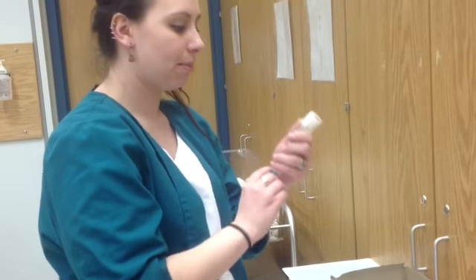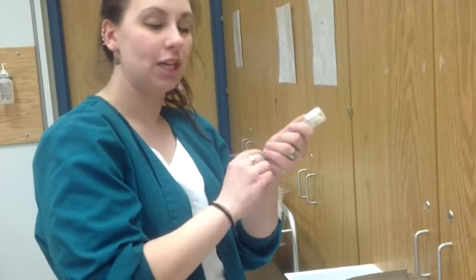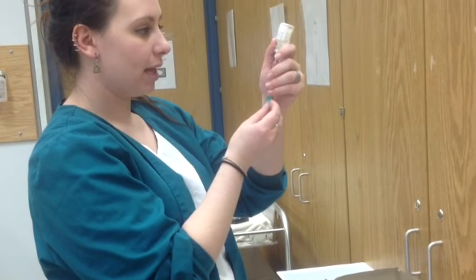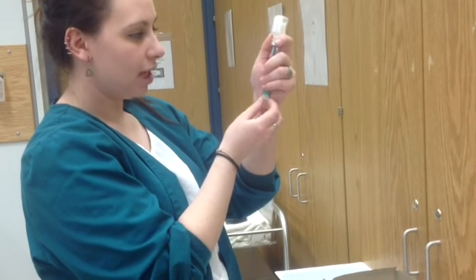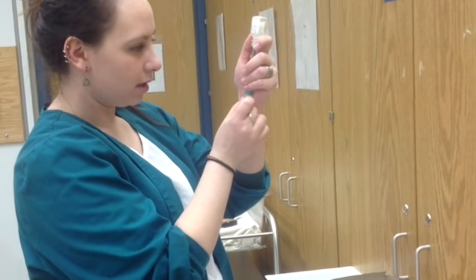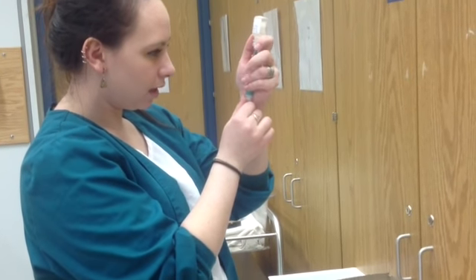Some medications you can't push the medication back into, so you'd have to start again. I'm going to then hold this securely, and I'm going to pull the plunger back until I get to the 1.2.